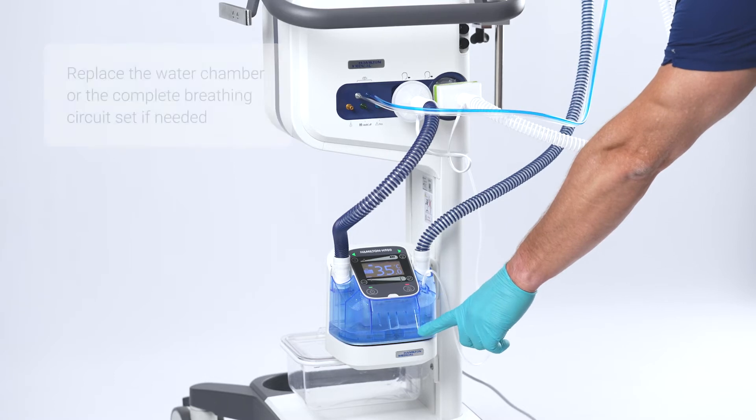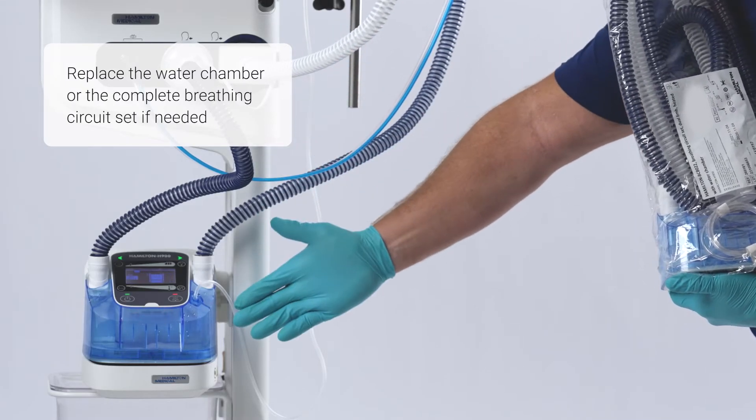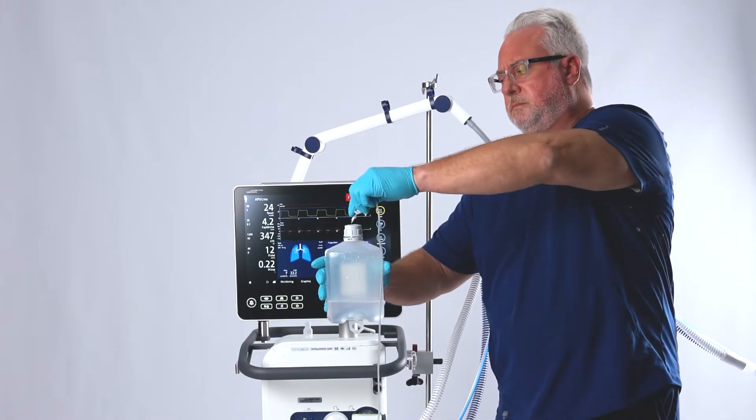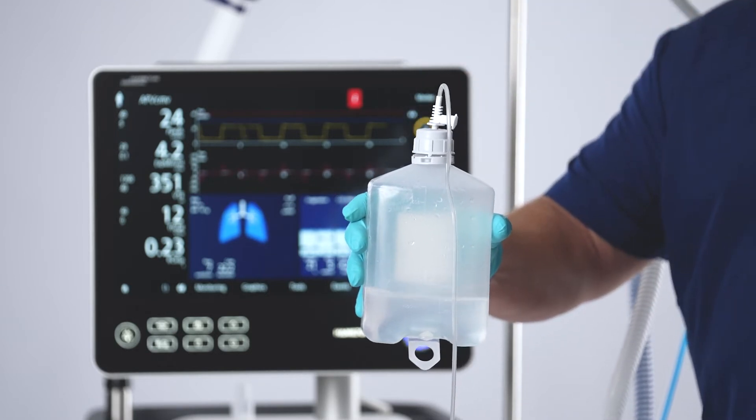If the alarm persists, you should replace the water chamber or replace the complete breathing circuit set. Spike the water bottle with a new chamber spike and ensure the chamber is filled to the correct level.